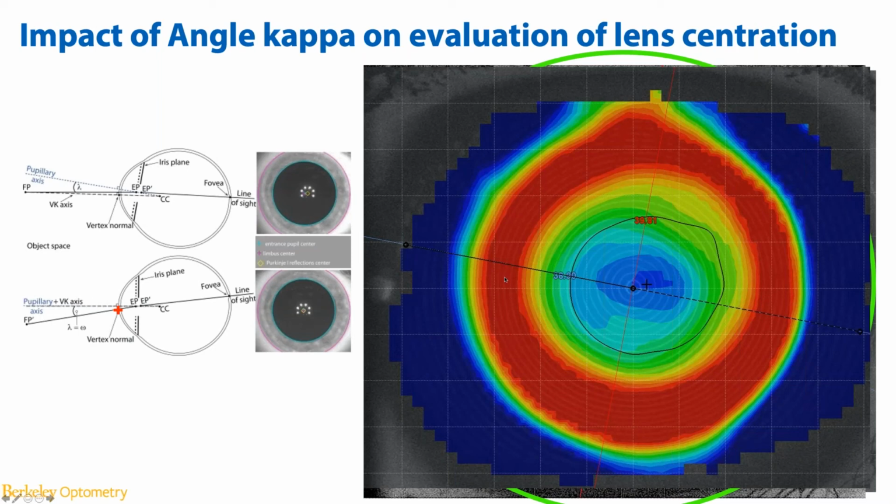Number one is the amount of paracentral steepening we're seeing, whether this is like a 2 diopter, 4 diopter, 8 diopter. Number 2 is the width of this paracentral steepening. Currently, we don't know if a narrower but more dramatic paracentral steepening works better than a wider but less dramatic paracentral steepening. And the third component is related to the size of the treatment zone, which is the location of the paracentral steepening.